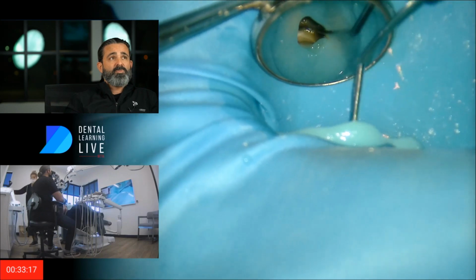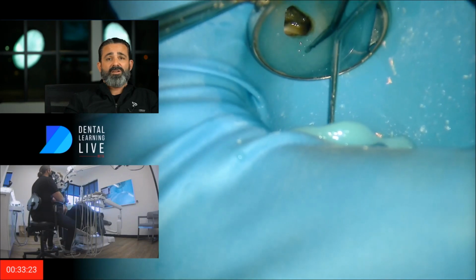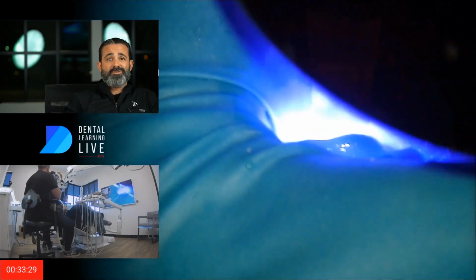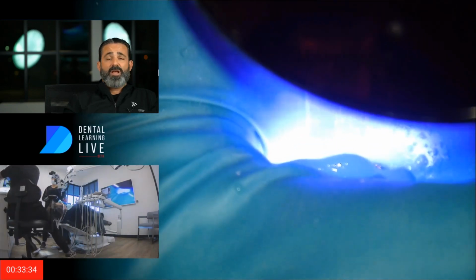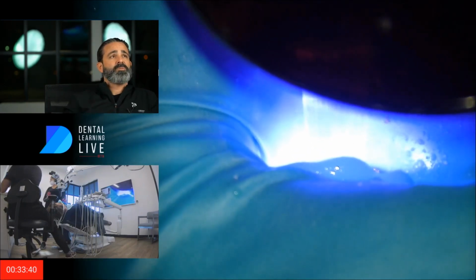And the cavosurface margin was fairly closed. But I just want to patch everything if I can. And it doesn't take me but a few seconds, as you're witnessing. So I patched myself, great. But, you know, I'm only 2-3 minutes into these builds, and it's no bother to me psychologically or emotionally when I do it this way. To me, it's always a logical progression forward, and I'm happy in that space.